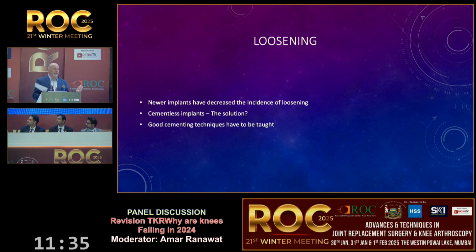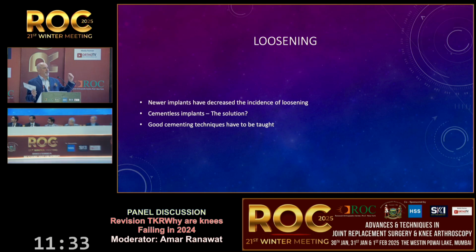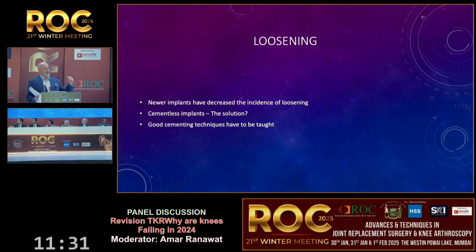Just like in the hip, not only is cementless faster and easier, but as I was trying to get you guys to speak, you have to do good cement technique. It's not just that a cemented hip is better, it's a good cemented hip, right? And good cementation of the knees. I think too many people take that for granted. They put the cement on, they start closing, and they're not paying attention to the fact that you need that cement to cure before you can move on.